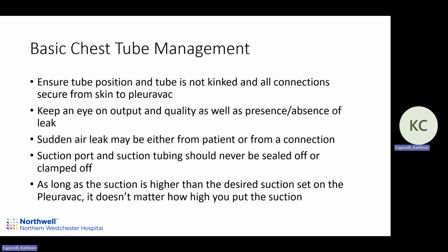Sometimes I will clamp the tube if I don't think they have an air leak, or I don't think that they're going to reaccumulate a lot of fluid, but I'm not 100% sure. Before I take the tube out, I want to do a test trial of clamping the tube. I'll usually clamp it for 4 hours, repeat an X-ray. If it looks good, I may take it out. I may keep it clamped until the following day.